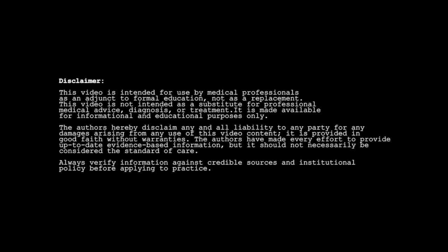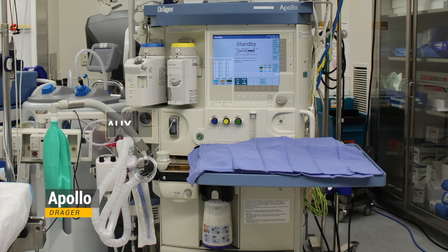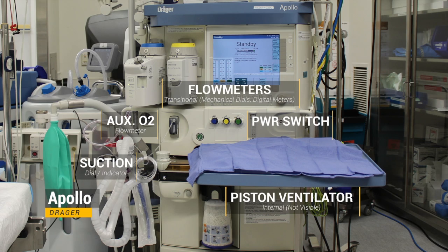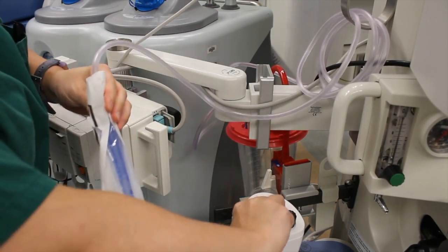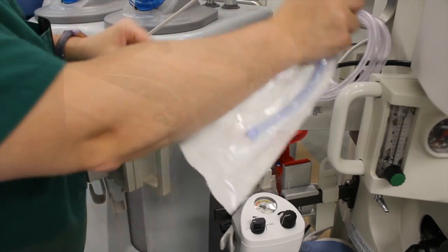It should be clarified that when talking about pressure or volume-controlled ventilation modes, these are not ventilation modes per se. They do not define or specify a mode; rather, they simply tell us which variable is being controlled during inspiration in the ventilation mode, but not which mode, since both pressure and volume can be controlled in sequences such as CMV or SIMV. In volume-controlled modes, the clinician must set the flow pattern, flow rate, trigger sensitivity, tidal volume, respiratory rate, positive end-expiratory pressure, PEEP, and inspired oxygen fraction, FiO2.